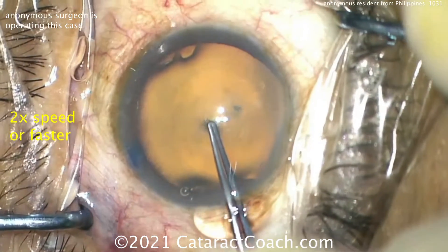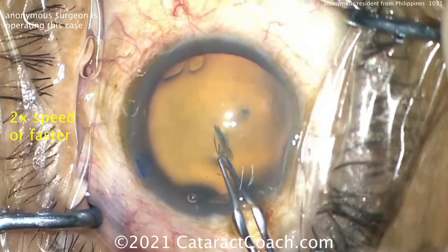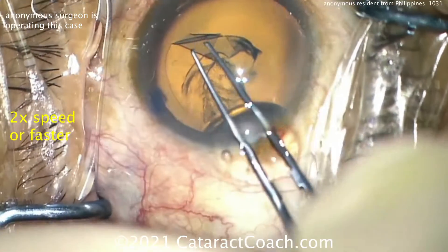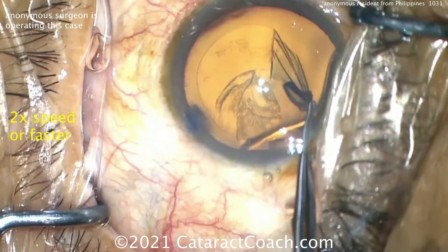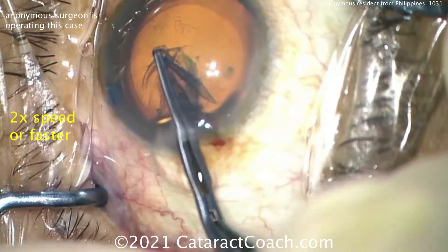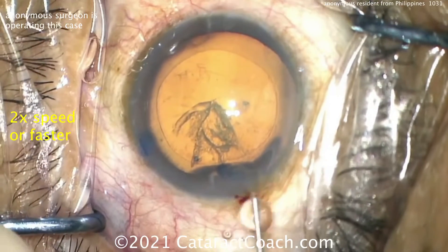Using these forceps to score the lens capsule and start the capsulorhexis — a little bit generous there. We'll see at the end when the lens goes in about the overlap, but this may be a little on the big side, especially to the left of the main incision. Completing that capsulorhexis — it's better than a baby rhexis. If you're just starting off and doing your first few hundred cataracts, avoid making that baby rhexis.